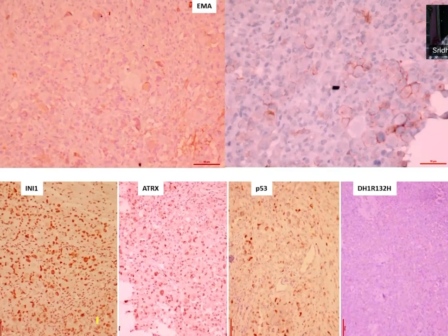Yes, sir. You said EMA, how will you interpret EMA? Here it looks like a few cells are showing membranous staining. Yes, so what does it mean? Positive. Will it tell us anything more? It reinforces your finding of epithelioid.